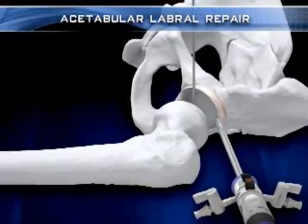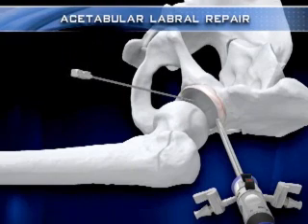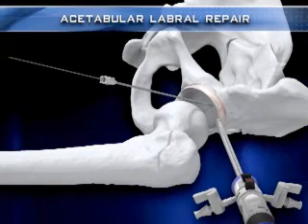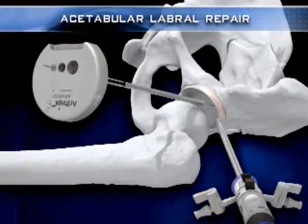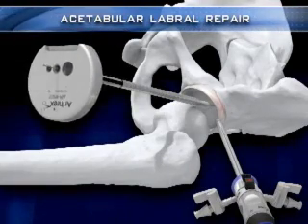The anterior portal is then established in an outside-in fashion under direct visualization using a spinal needle. The needle is replaced by a flexible nitinol guide wire, so the 5 mm and 7 mm portal dilation sleeves can be used to dilate the hip capsule prior to shaver insertion.